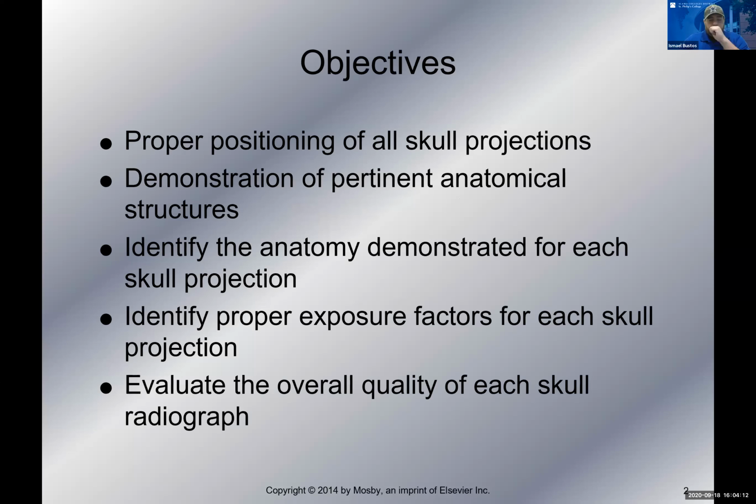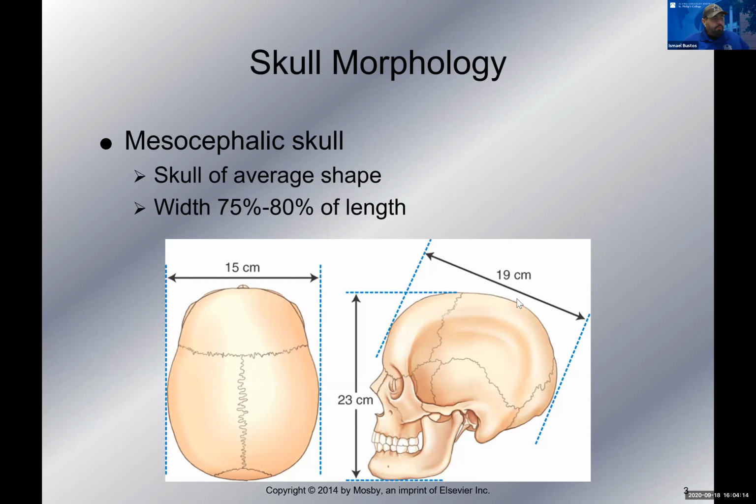So today we're going to start to talk about the skull projections in chapter 11. So let me go ahead and bring up the PowerPoints here. All right, chapter 11. Here are the objectives. Before we get started in actually talking about the projections of the skull, we first need to go over some of the considerations for positioning of the skull. Some important things you need to remember when you're positioning the skull. That way you can better position the patient.